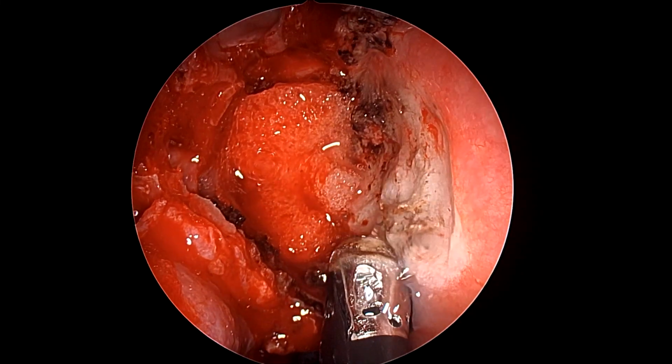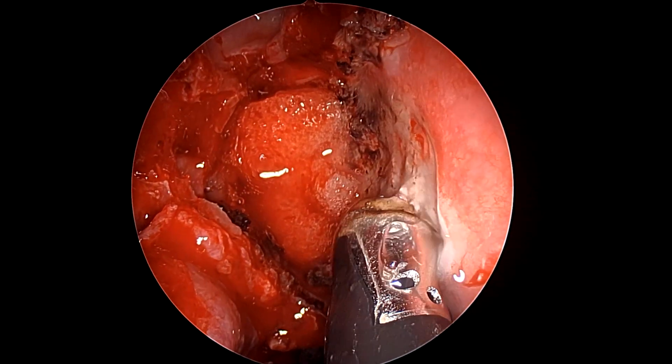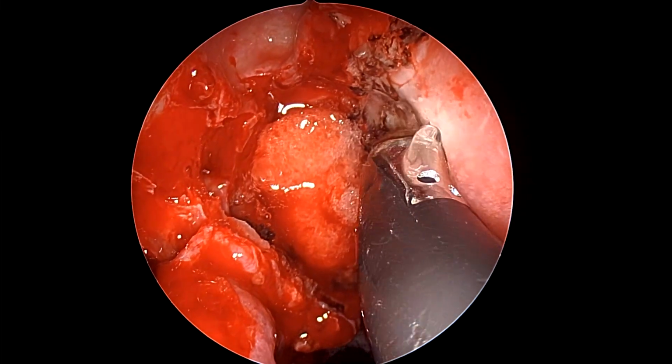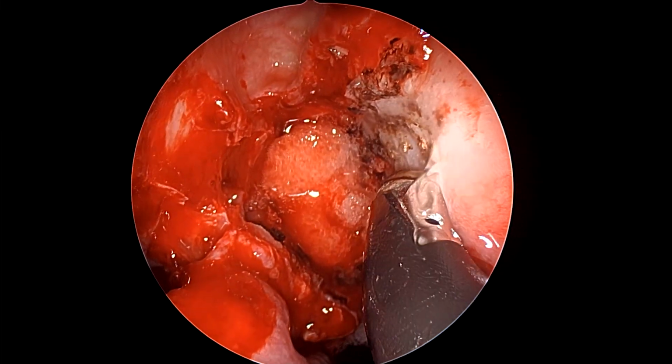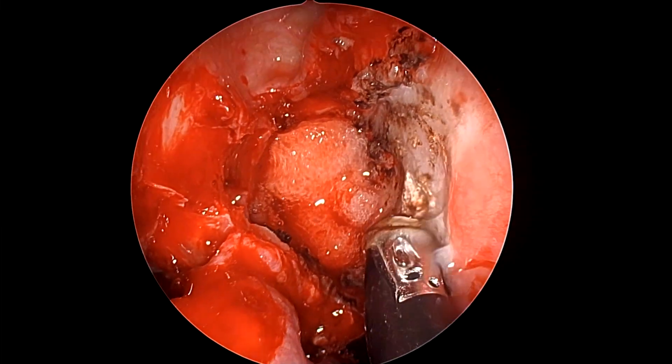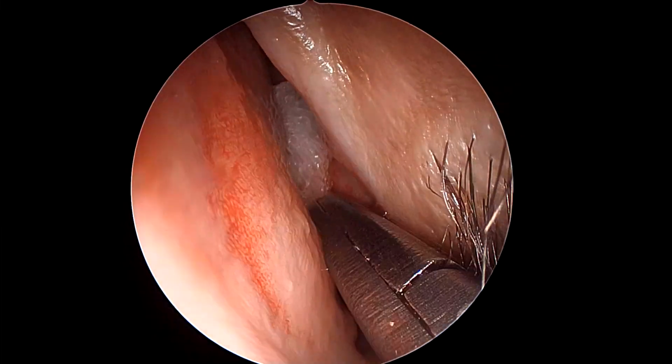and also avoids morbidity, because practically we do not contact the lateral nasal wall at all. Now you see that in the sphenoid we have placed a saline soaked Medocell patty, while we are using our ablation onto the posterior part of the septum on the ipsilateral, that is the right side. We go high up to the planum.